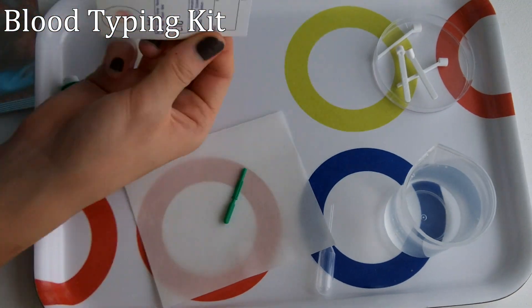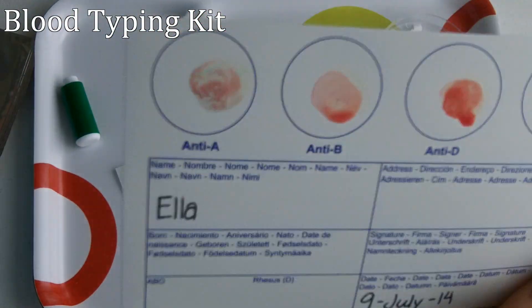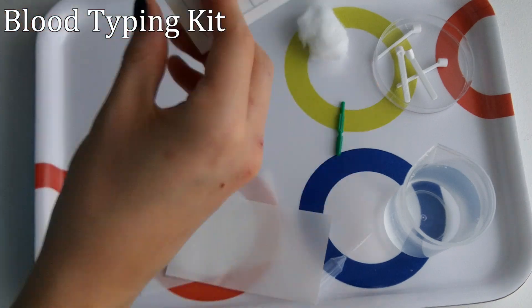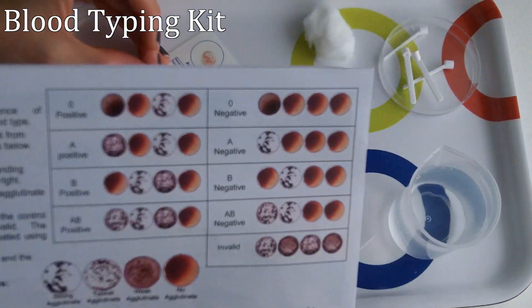Here, I am tilting the card to distribute the blood within the circles. Next, I placed the laminating sheet on top of the card. I compared my blood type to the pictures on the back of the card to determine my blood type.